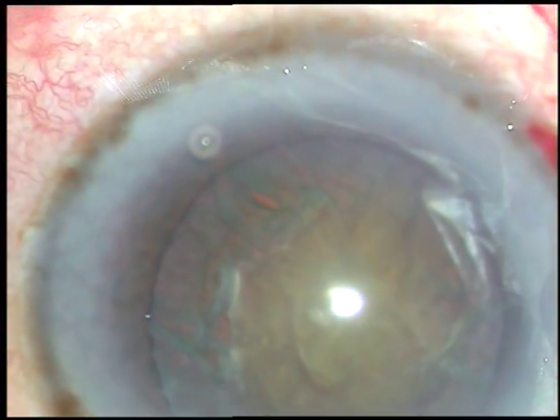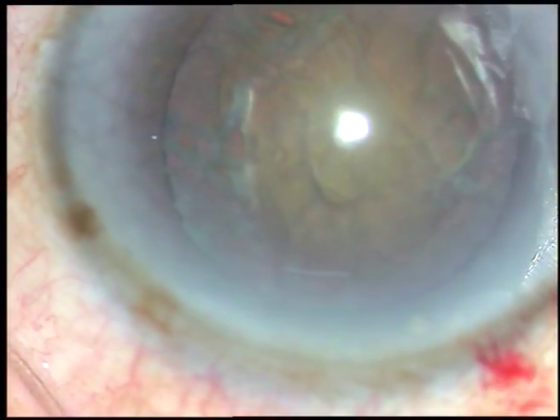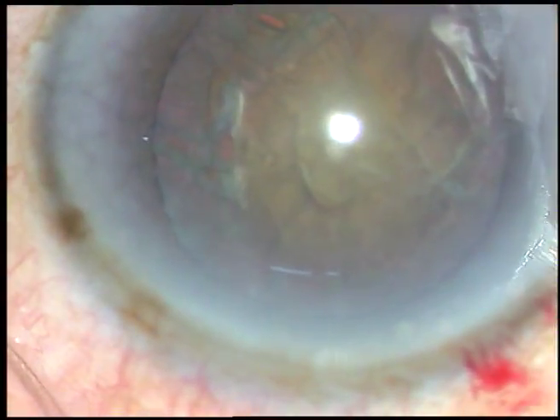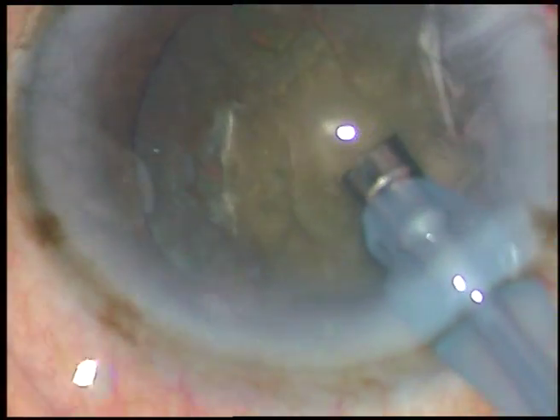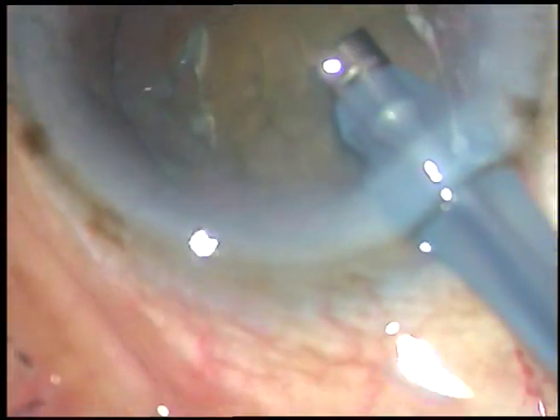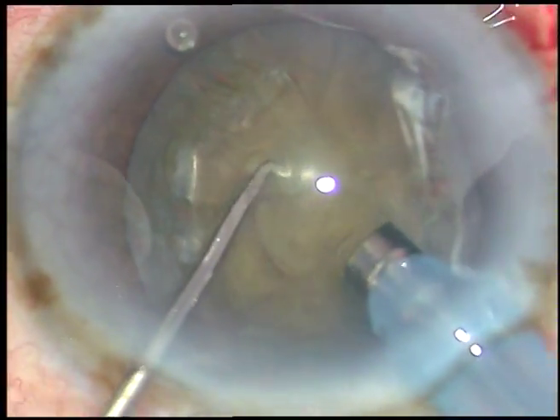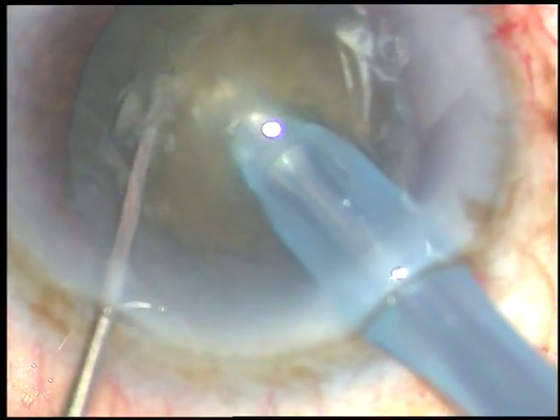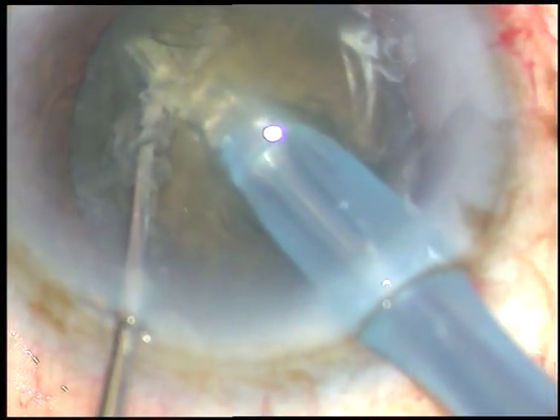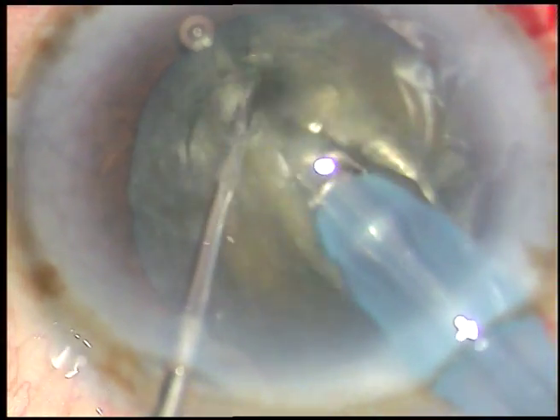I usually do submarine chop, which is a variety of horizontal chop. What I do is directly enter into the substance of the nucleus — the tip of the phaco handpiece is buried into the substance of the nucleus. Phaco power in this case is about 75%. The tip goes towards the opposite equator.